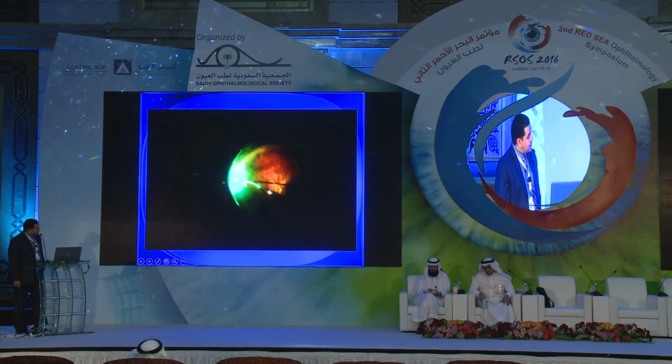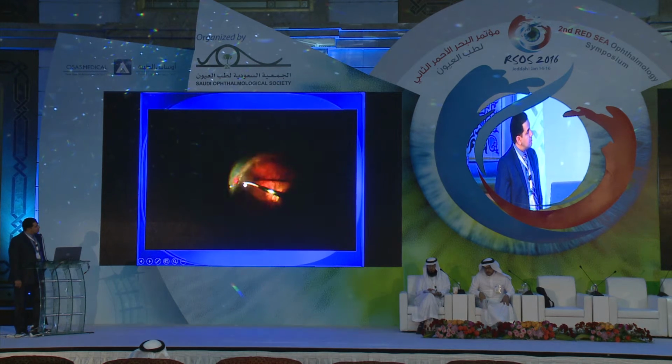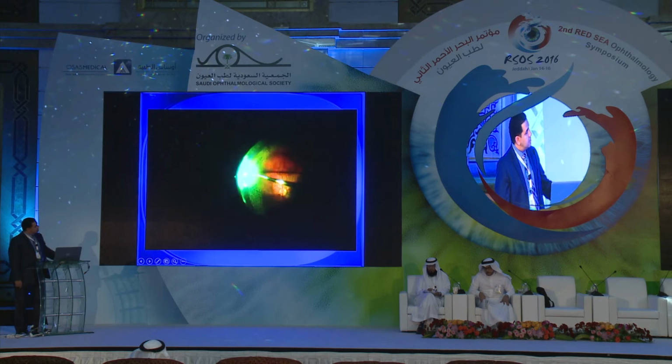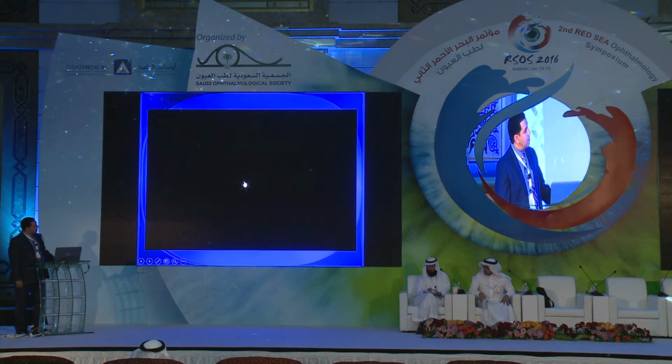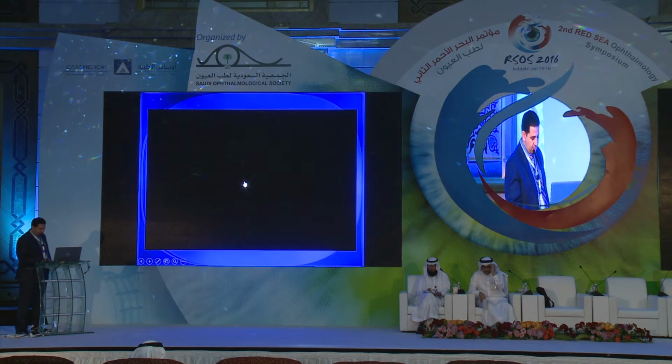And in this case, I prefer to do 360 endolaser because I was afraid there might be some small holes, since the IOL was stuck in the periphery. Also, I left the case on air. I made an air fluid exchange.